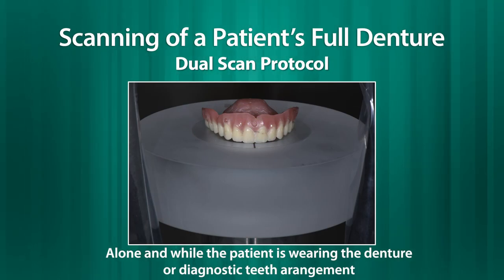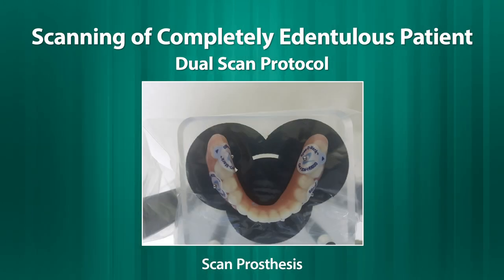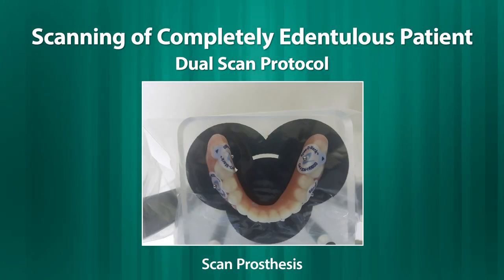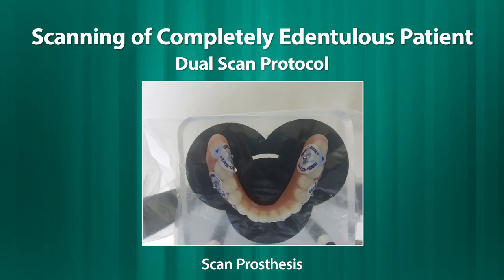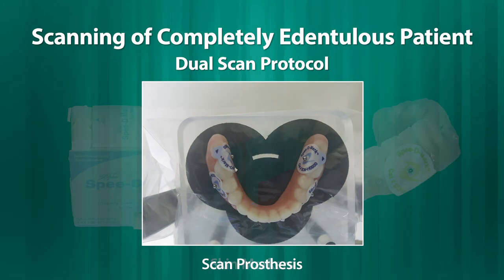While for a completely edentulous arch, we follow a dual scan protocol, which involves two CBCT scans: one for the patient's denture, or what we sometimes call the scan prosthesis, and the second one for the patient while wearing the denture or scan prosthesis. The scan prosthesis is an existing removable prosthesis or a radiolucent duplicate of the diagnostic teeth setup with dual scan markers integrated or glued into the surface.